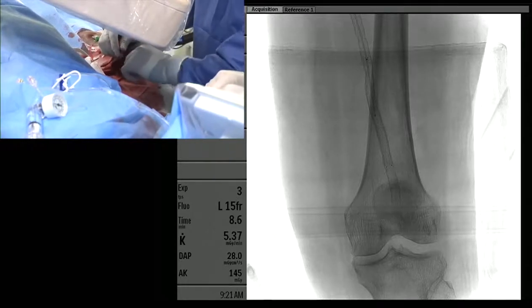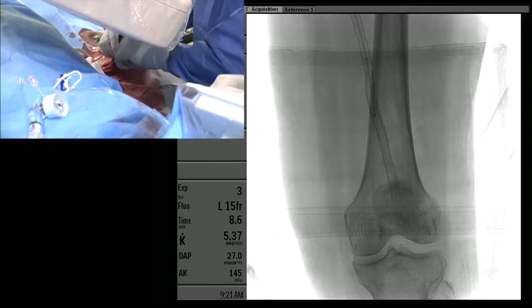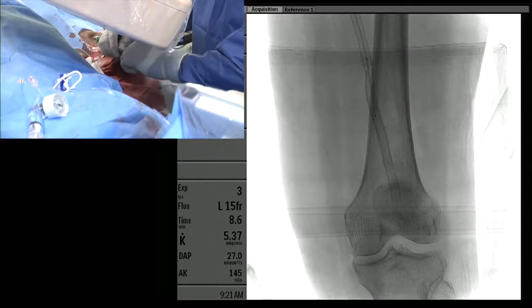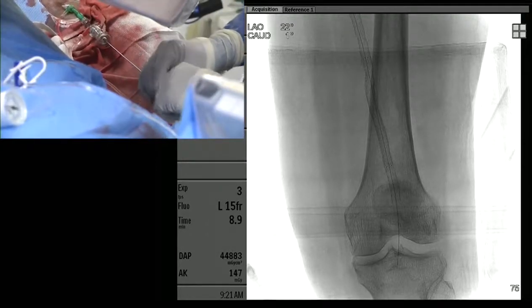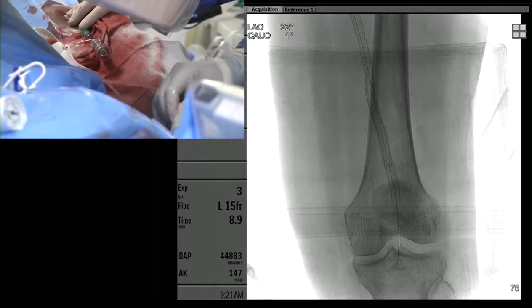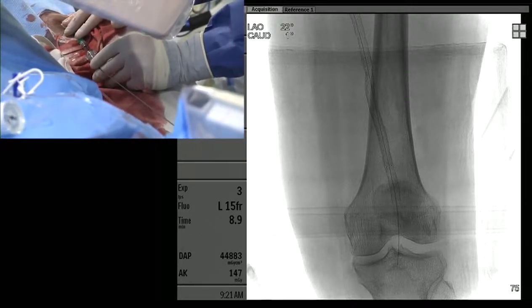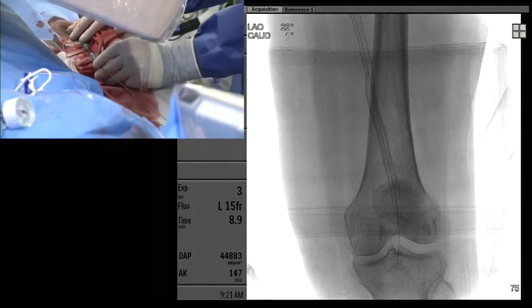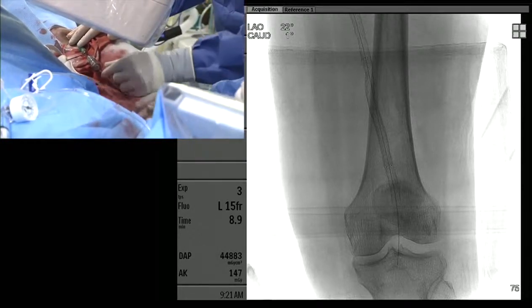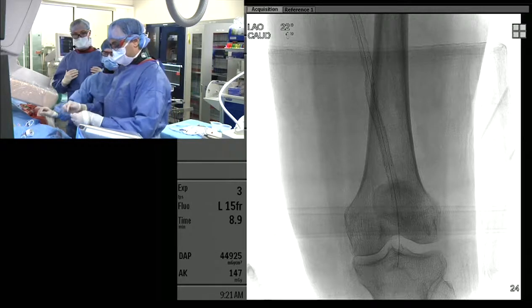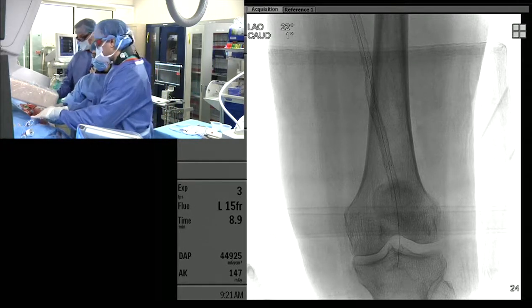The Sarah catheter was used really just to get down the arch. We're showing you the difficulties of doing PAD cases through a guide, because with the guardian and the hub, you lose a lot of length. This afternoon, we'll show you the sheath approach which is a bit smoother.